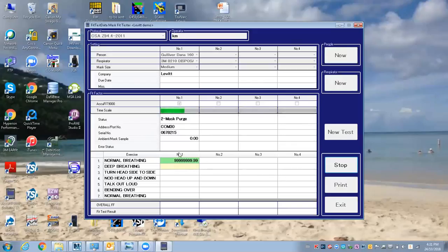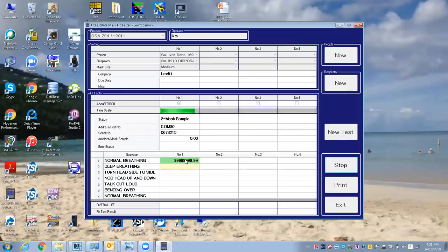I'll stop this as well because it's going to go through each exercise. You can see that it's green if it's a pass. With this mask, the half-face respirator, it's only a pass mark of 100.